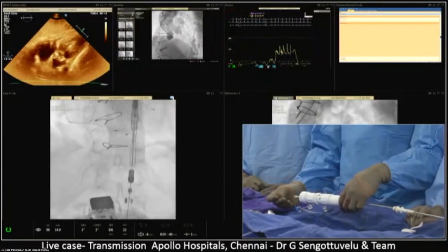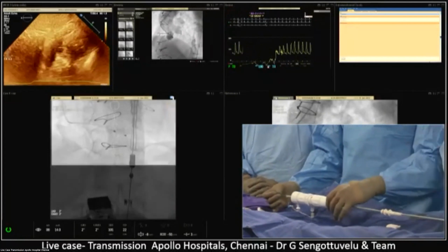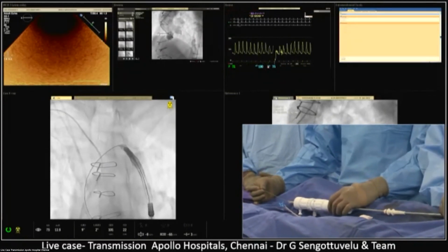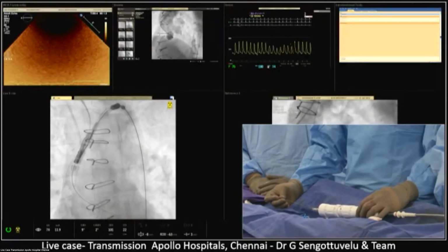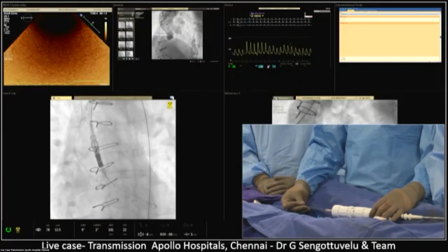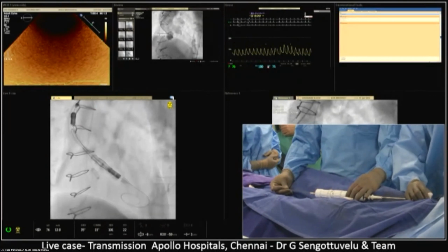Okay, can you show up now? The nice thing about the Accurate is it's a very flexible catheter, so some of these arches it tracks very nicely. I think it's a very sleek system. It's a nice sheath and a nice catheter delivery. The delivery will be across. Check the pigtail small test. But it's a very different deployment for people that haven't seen it.